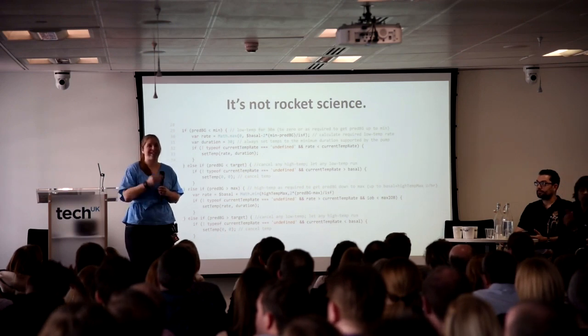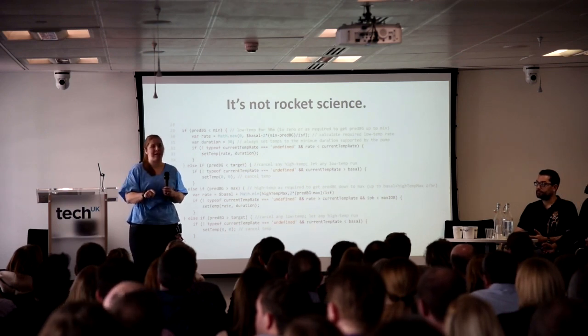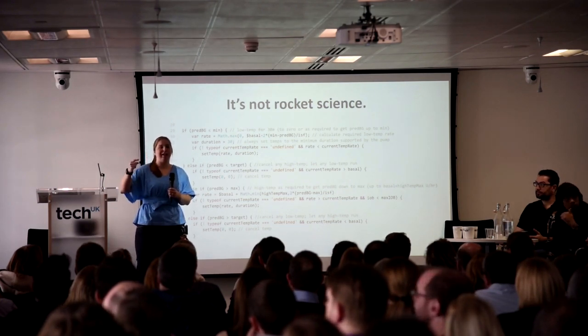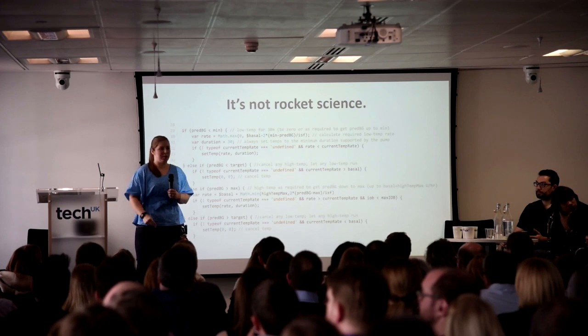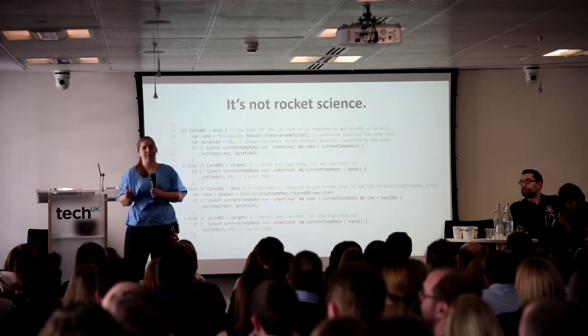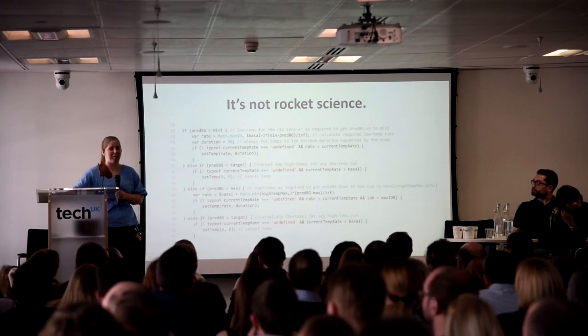It is the same math that every person in this room with type 1 diabetes does. It's if this, then that. If my blood sugar is going to be high, I need more insulin. If my blood sugar is going to be low, I need less insulin. And then it just tells the pump what to do. And it breaks that out across 5-minute intervals, so it can give very, very small commands that add up over time.